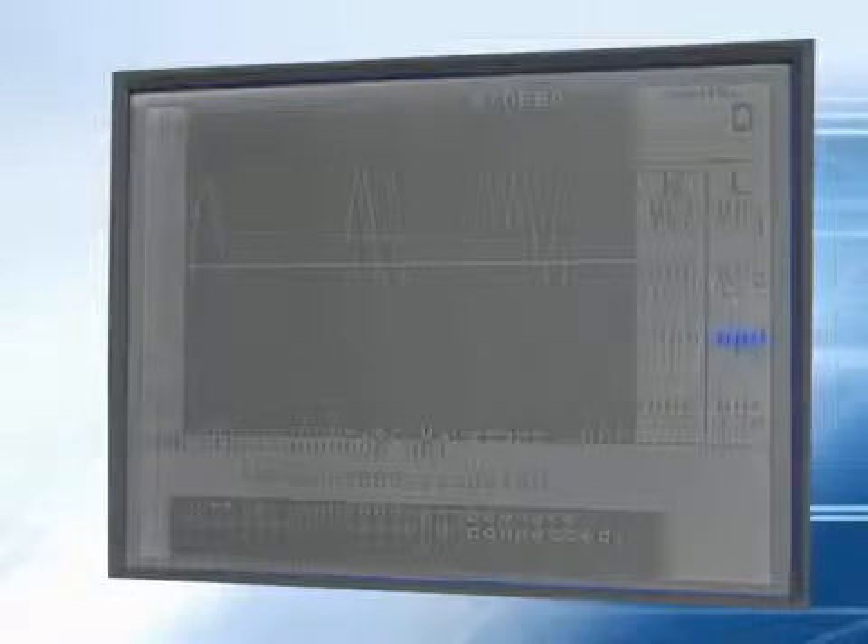Start at the patient's right brachial to obtain the systolic pressure. Obtain the right ankle wave form, then the right ankle pressure. Next, move to the patient's left side to obtain the left ankle wave form, then the left ankle pressure, and finally the left brachial pressure.